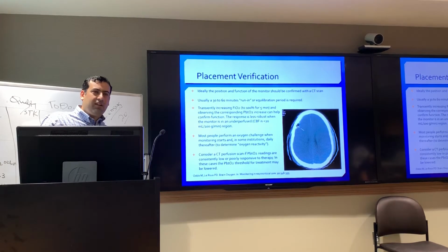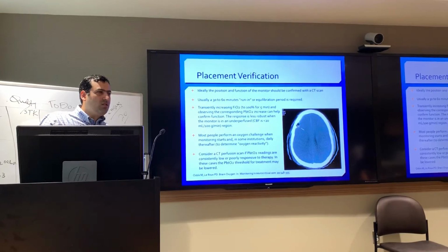And have you ever had any probe that was in long enough that you think it was not working anymore? No. The longest one we used, I would say, we started with a day 15 patient, and then we monitored to day 25. That patient happened to be a late presentation, giving us the result.